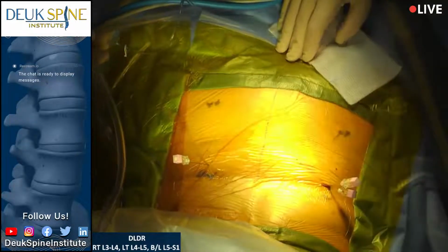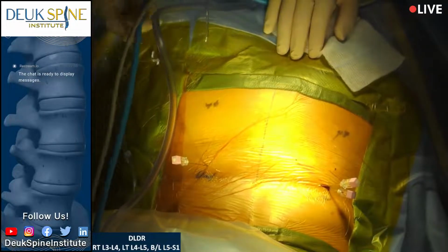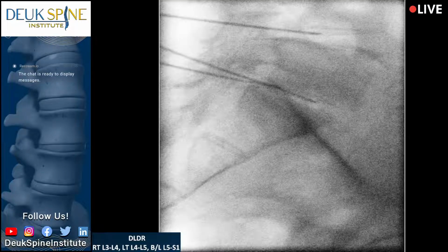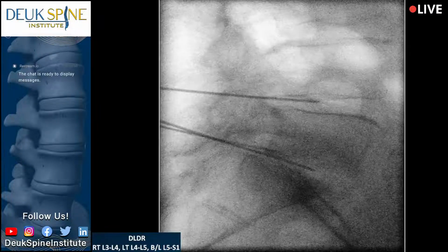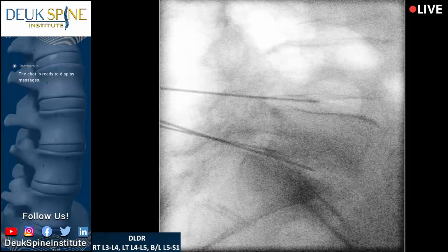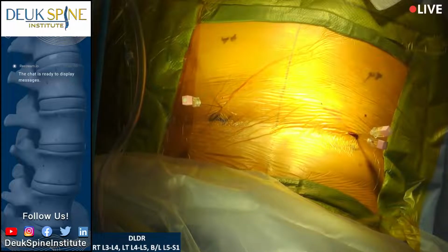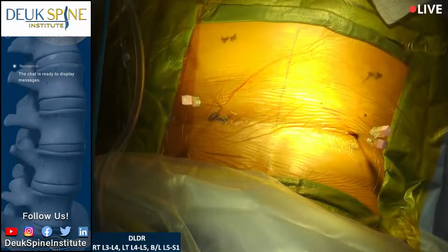I feel a little bit here. What can you do to improve that image? I think it's a bit overexposed, and I think we're too far south. If that's accurate with the pedicles, then we need to go further north with the unit. All right, now we're off on orbit quite a bit. That's better. But our WAG, I think, may be off a little bit. No, we're overexposed. Shot, fix the WAG a little bit. I'm still off on orbit too. You've got to be able to see the spine three-dimensionally in your mind and relate that to the X-ray.